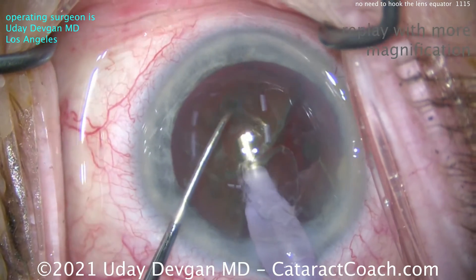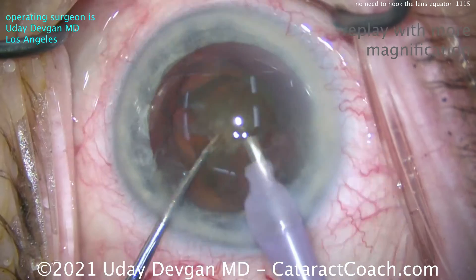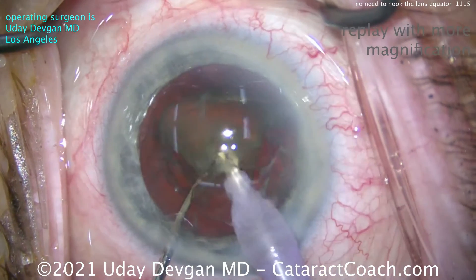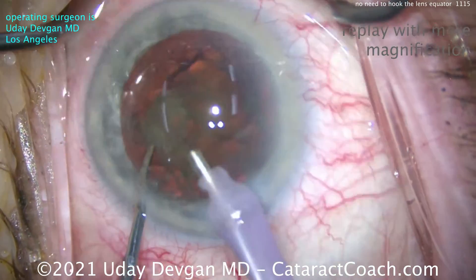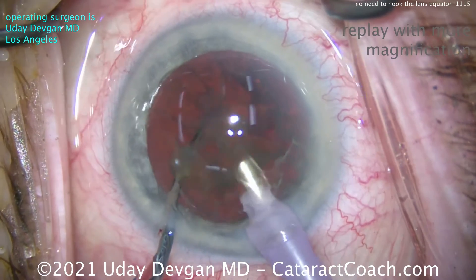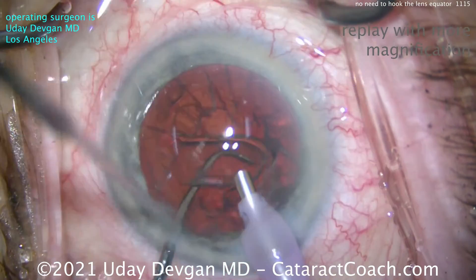For the last half, here's a traditional horizontal chop — the chopper going around the lens equator — and then break off a quarter. The last quarter is in the capsular bag. Notice how we keep the irrigation primary the whole time, and the chopper is used to push that last piece in front of the phaco probe. The back end — the smooth, curved side of the chopper — is facing the posterior capsule, just in case there's some surge, so we don't want that posterior capsule to come in contact with the phaco probe.